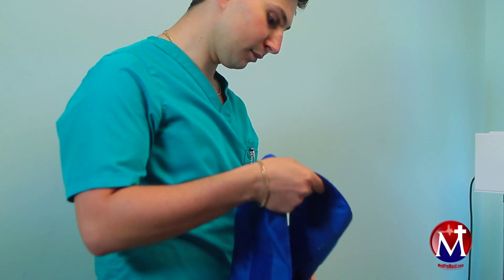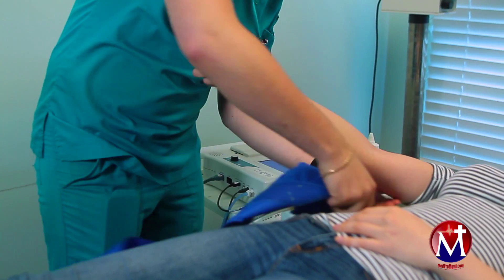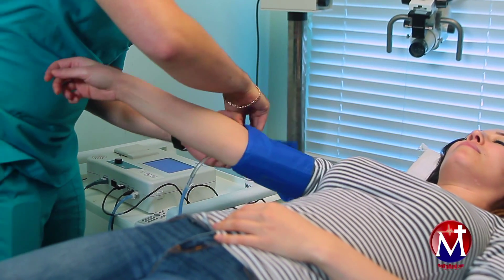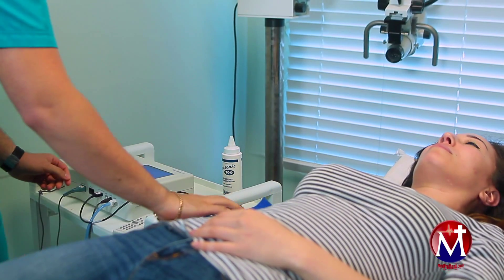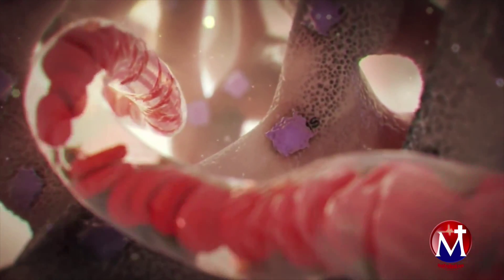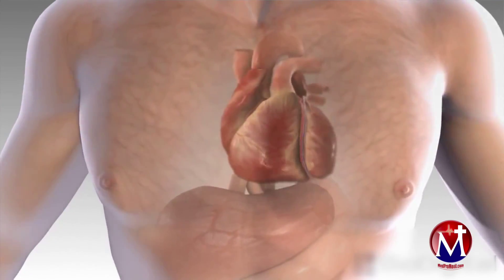Eugene is going to be performing an ankle brachial index exam on this woman. The ankle brachial index is a non-invasive test used to determine a patient's risk for peripheral artery disease, a condition that involves a narrowing of the arteries in the leg and that can lead to a heart attack or stroke.